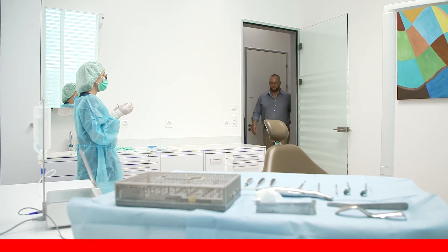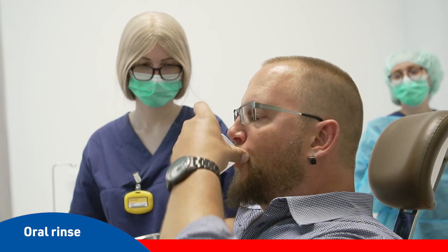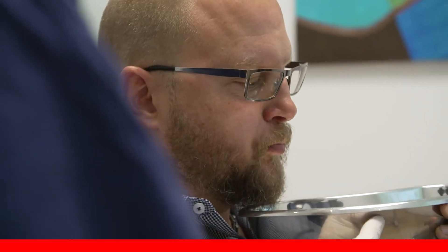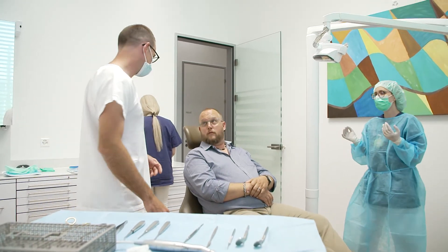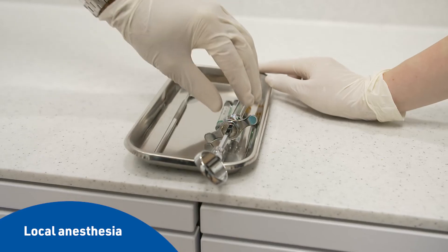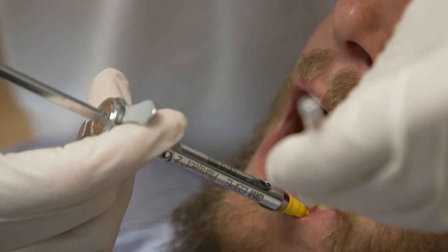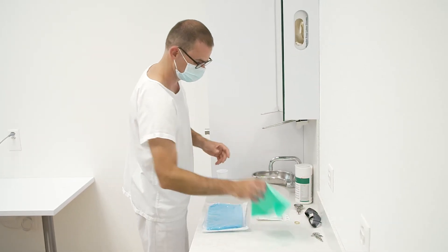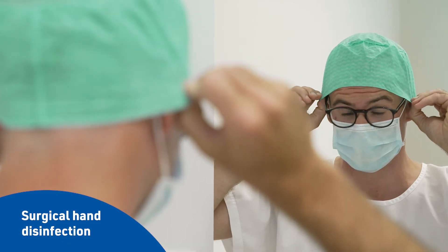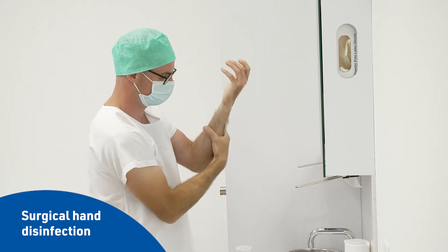The patient is brought into the room by the second assistant and instructed to disinfect with oral rinse. The surgeon greets the patient and final questions are clarified. Local anesthetic is administered. The surgeon then performs hand disinfection and finalizes his surgical attire.